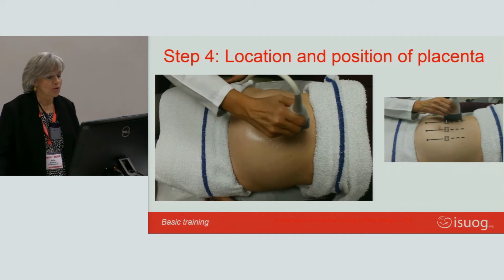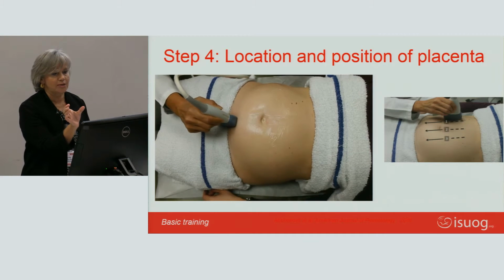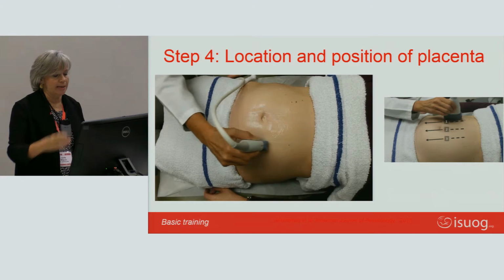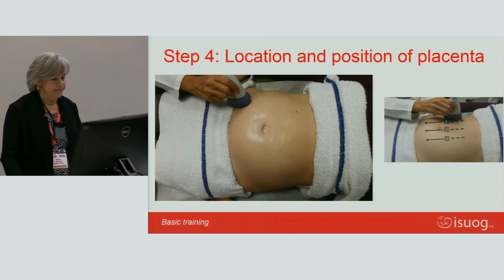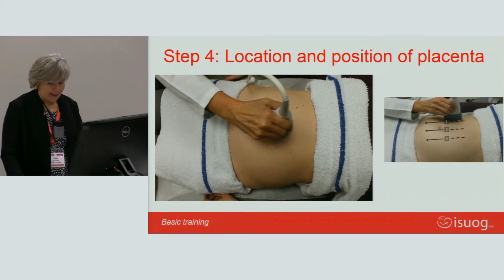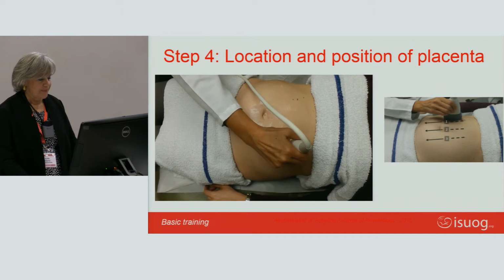So look at the position of the probe. The probe is always kept, whether you hold it transversally or longitudinally, perpendicular to the floor. I think this is quite clear.